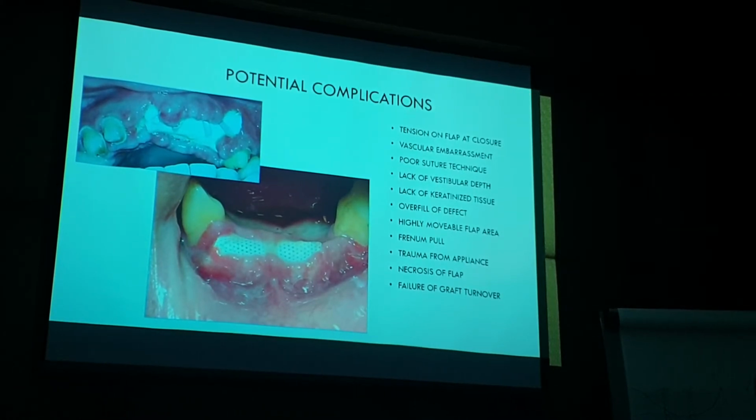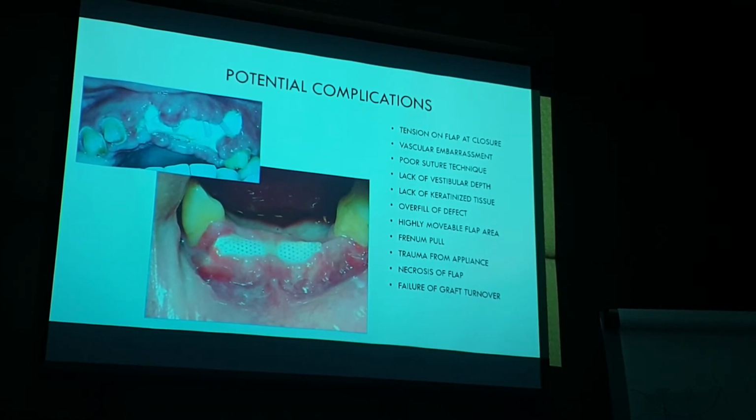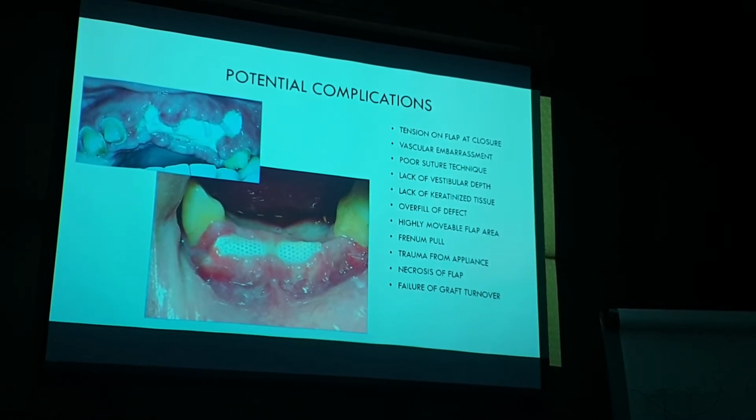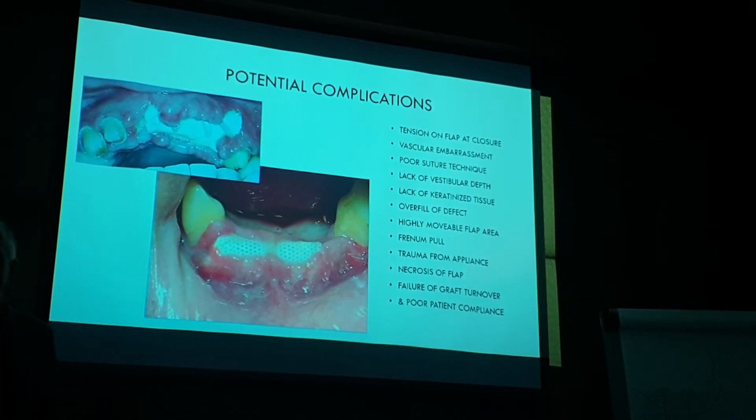Root canal, atrophy, ankylosis. Then, because it's ankylosis, there's no more stress relief in function, we have a fracture of the tooth. Now we remove it, we look down, we see no bleeding. Why? Because the lamina dura around the tooth has become cortical bone. That's why. We put graft in that, we come back in 4 months, there'll be nothing but graft material. What do you need to do there? Then of course, poor patient compliance.